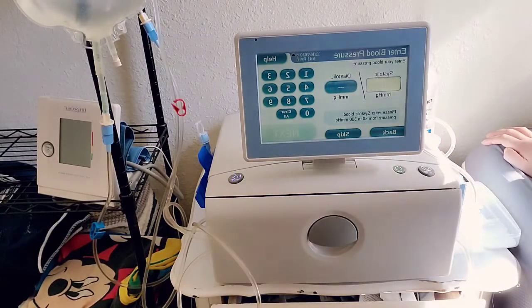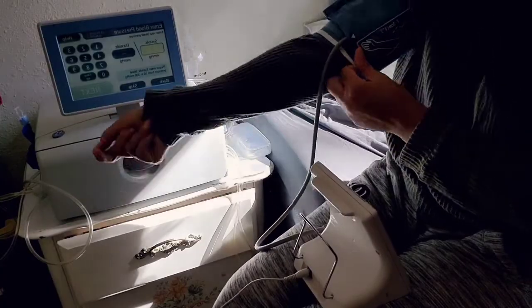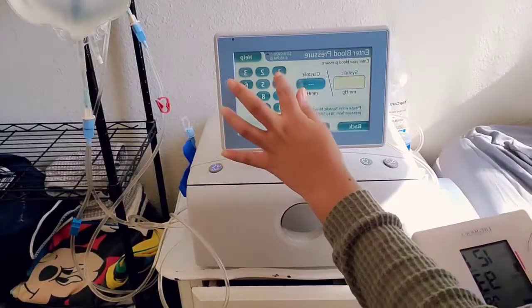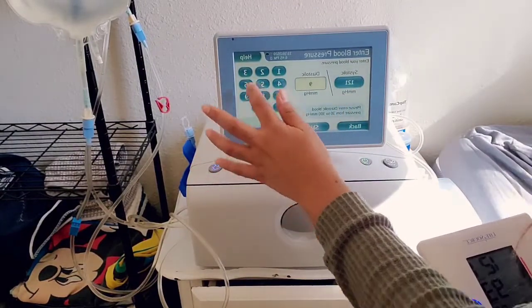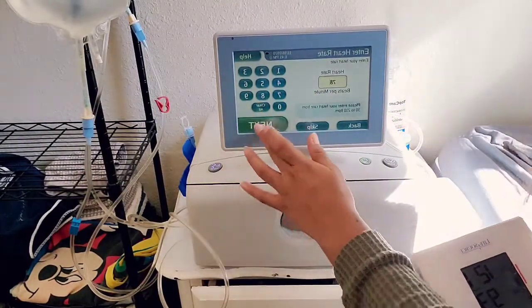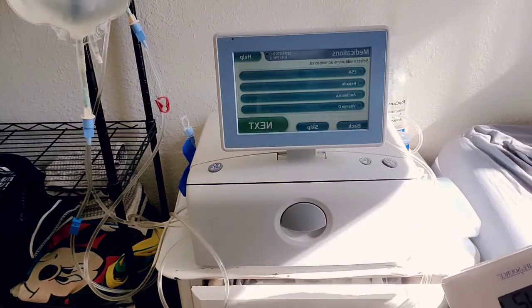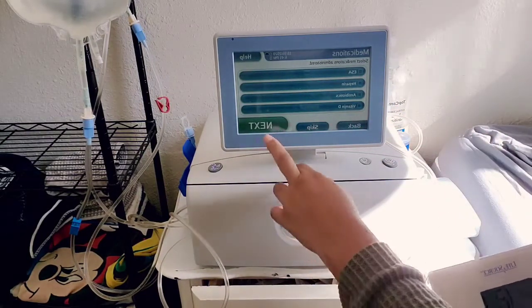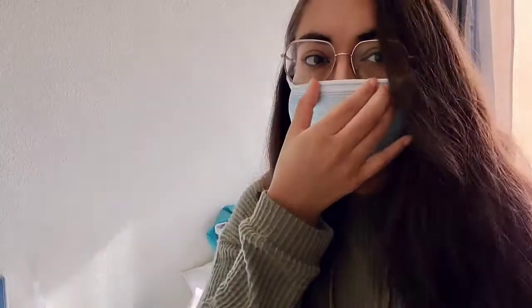Now I take my morning blood pressure. Make sure this part is centered on your arm. I got 121 over 93 — entering that — and pulse is 78. I didn't add any medications today; I want to ask about vitamin D but haven't yet. I hate wearing glasses with a mask because it gets all foggy. Press next.